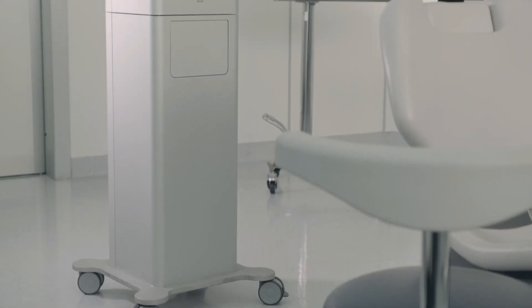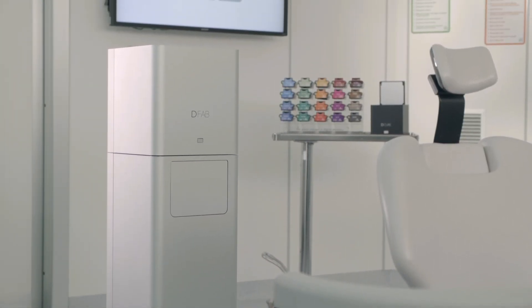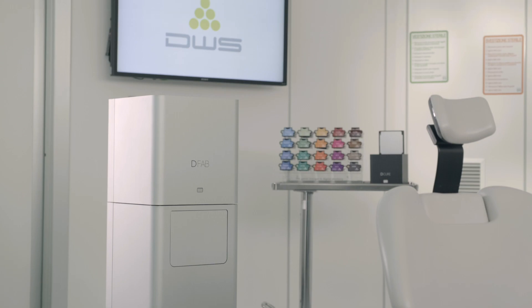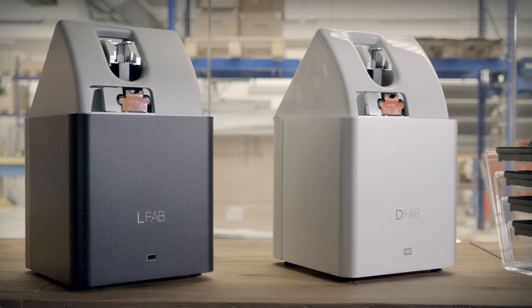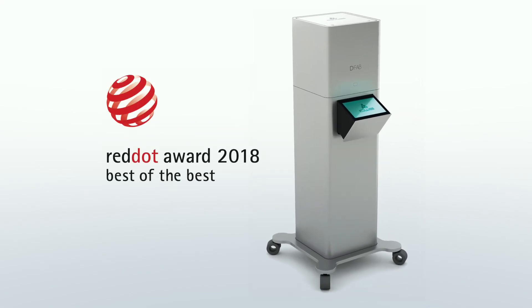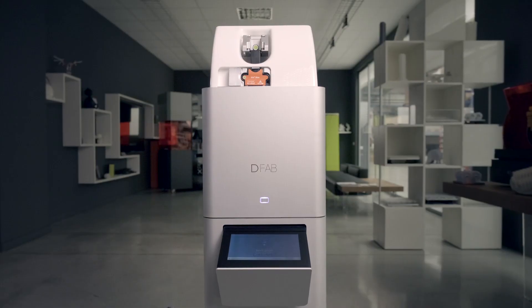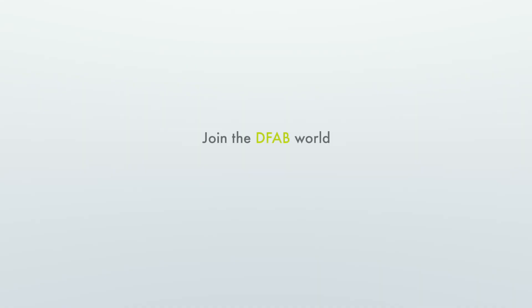D-Fab stands out not only for the high technology it implements, but also for the attention to aesthetic design. The functional, sleek, minimalist look of the D-Fab family was awarded Best of the Best in the 2018 Red Dot Design Award. Join the D-Fab world. Open the doors to the digital dentistry revolution.